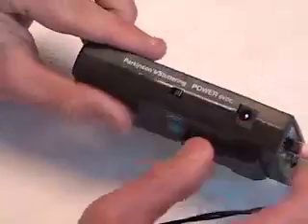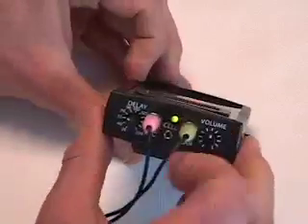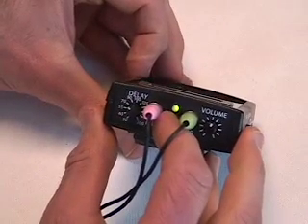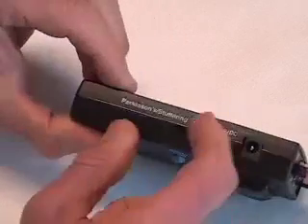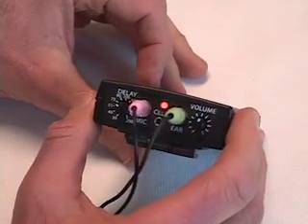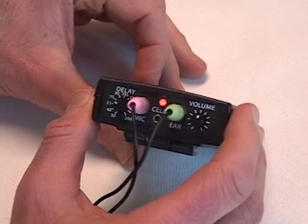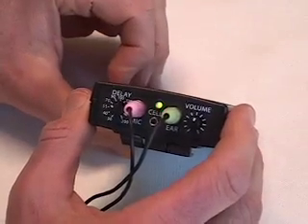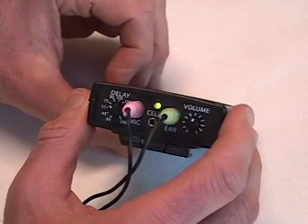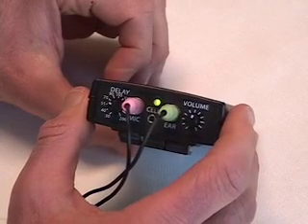The device also has a switch for stuttering or Parkinson's. In stuttering mode, the green light indicates relaxed speech and the red light indicates tense speech. In Parkinson's mode, the red light indicates relaxed, quiet speech, and the green light indicates that you have adequate vocal volume and vocal fold tension.